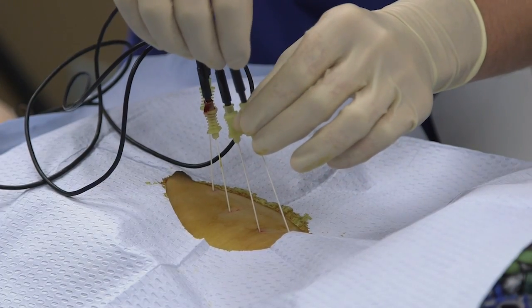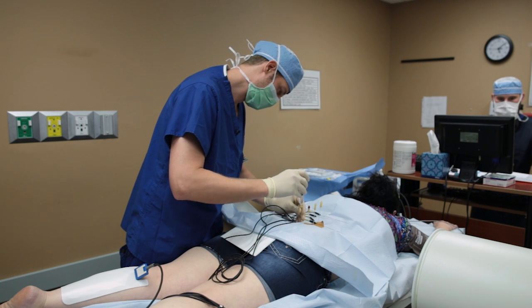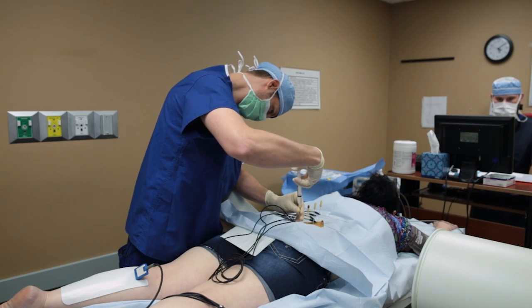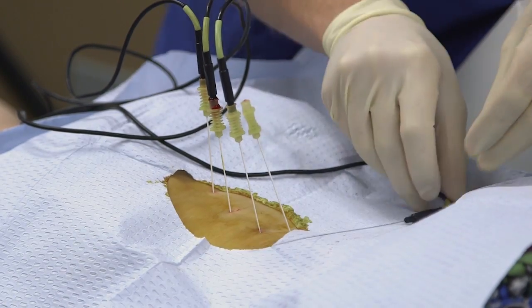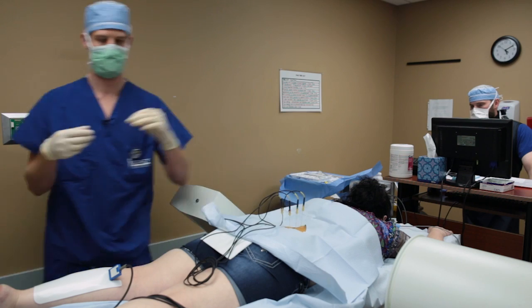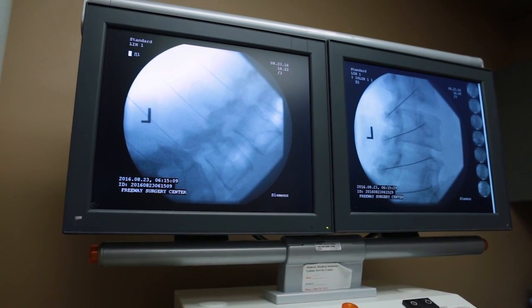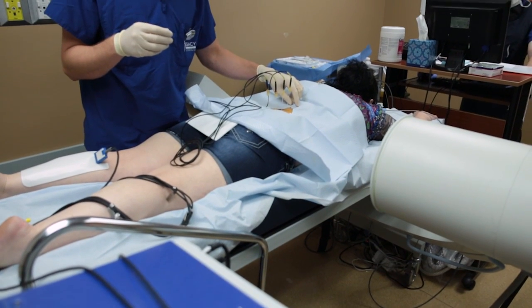We'll then remove the probes temporarily and put some numbing medication into the needles, then replace the probes. We'll take another x-ray to confirm the needles haven't moved and are still in the correct position before we proceed.